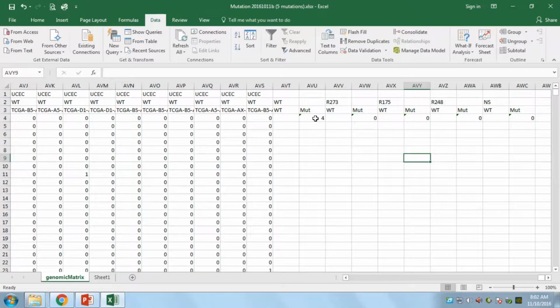Okay, so this is basically the number of mutations associated with each P53 status. Now, the next thing I want to do is know how many cases are the wild type genes that are associated with different p53 mutations. So I need to know the total number of wild type cases minus the cases that are mutated, then that will give you the number.